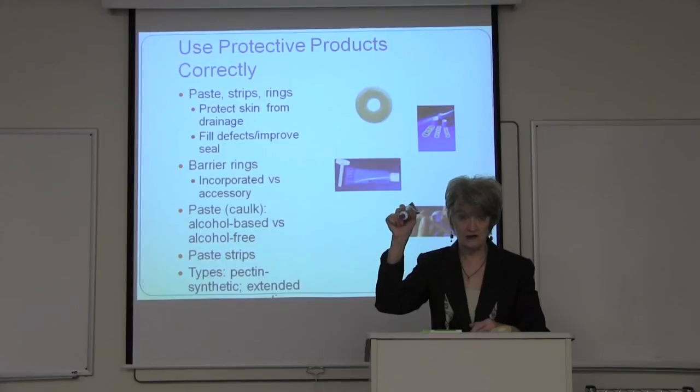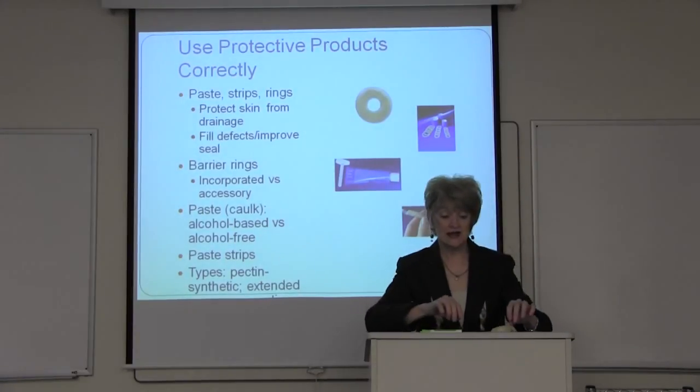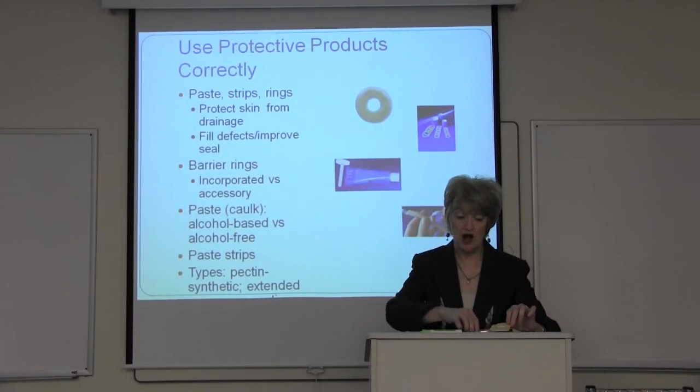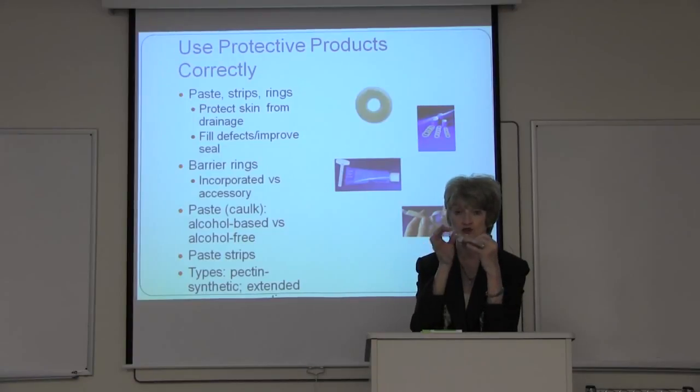Standard caulking, standard protection, intact skin, tube paste. Standard protection, standard caulking, damaged skin, we typically use strip paste.